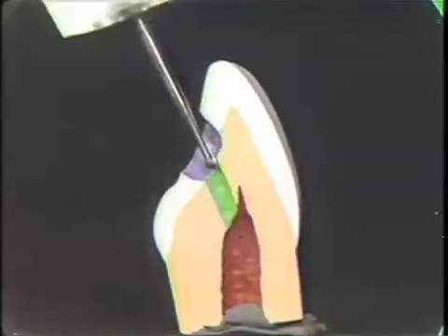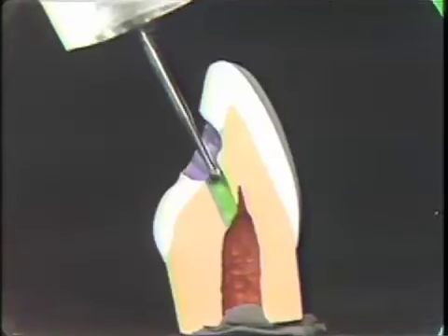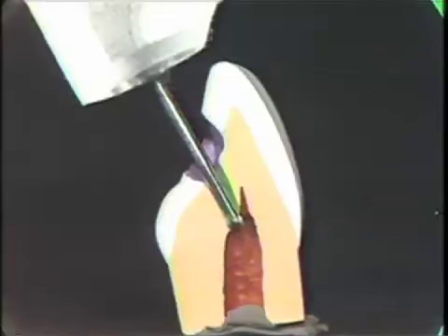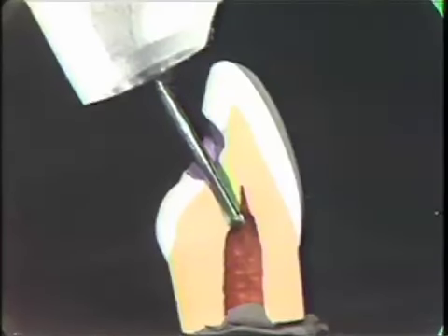Now, here you can see that someone has gone the wrong direction twice. He didn't realize the angulation, the long axis of the tooth, so he stopped, took a radiograph, then he can reorient his burr to the long axis of the tooth and go directly on down. Once you feel the burr drop into the pulp chamber, stop the handpiece from running.